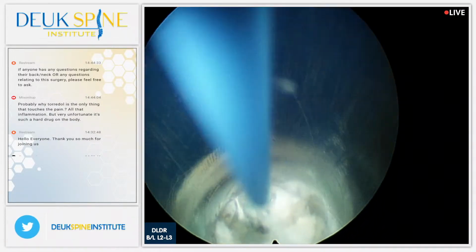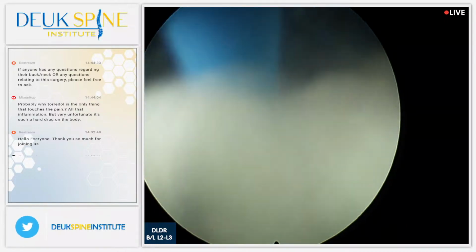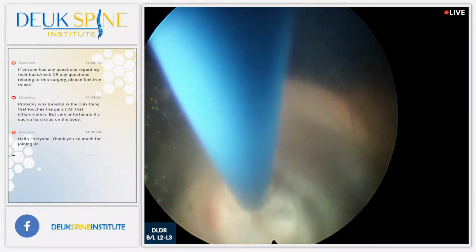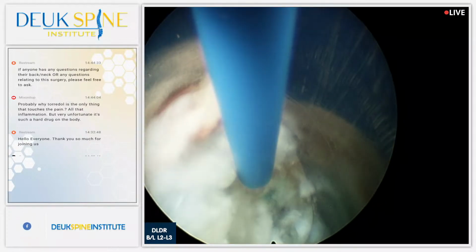That's the tear. Hold the tube. Guys, the irrigation is good?